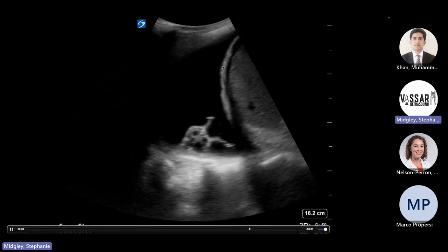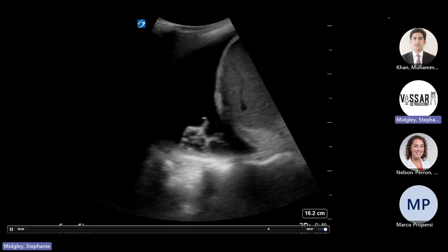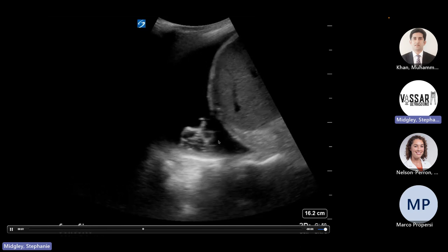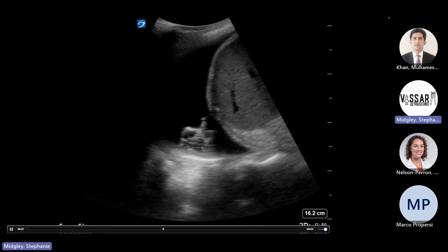And then you can see here's diaphragm, there's spleen. We have our spine sign. This is just like atelectatic lung or a little alien waving at you, whichever you'd like it to be. Or a little fat guy that's upside down and his legs are wiggling in the air. Planking.